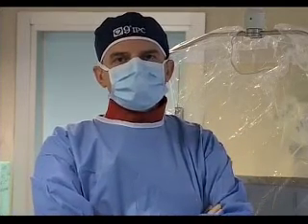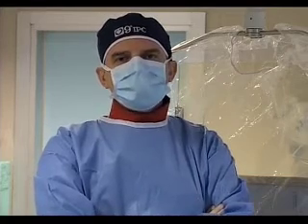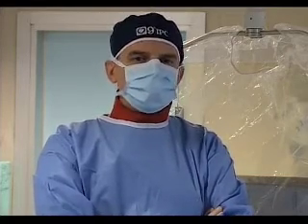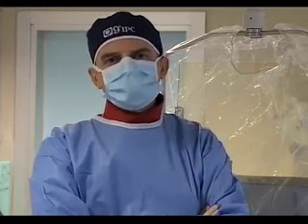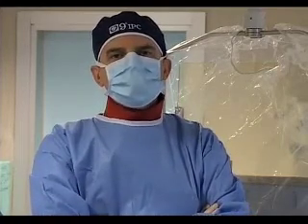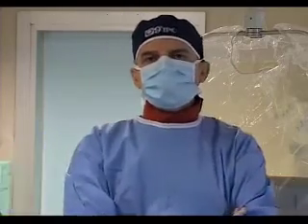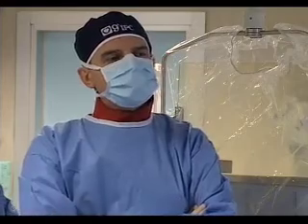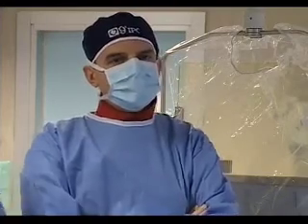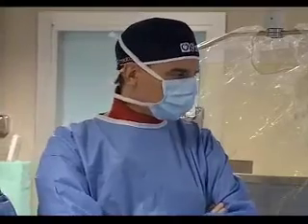We were wondering about the possibility of implanting a bare metal stent in this child because of the weight, but because we have the possibility to use the new advanced stent that can be introduced through a small long sheath, our option at the moment is to put an advanced pre-mounted covered stent. I don't know what you think about that. What's your suggestion?